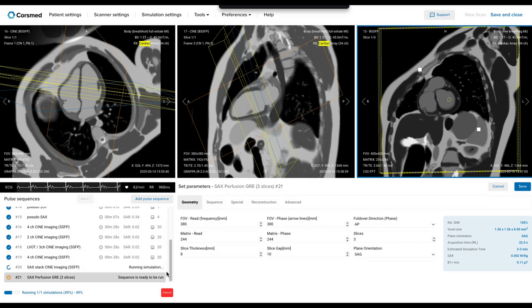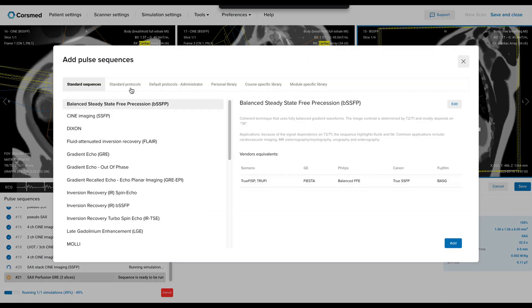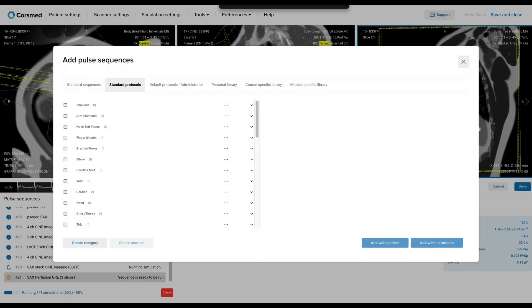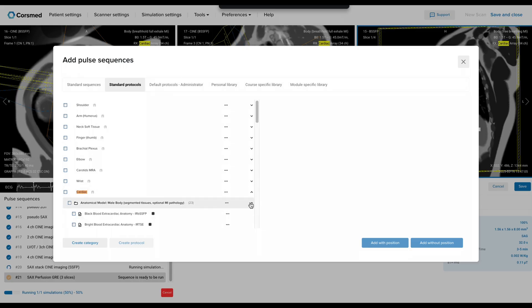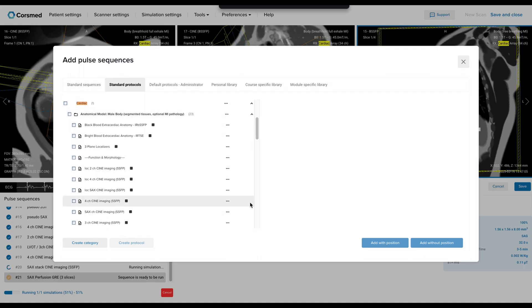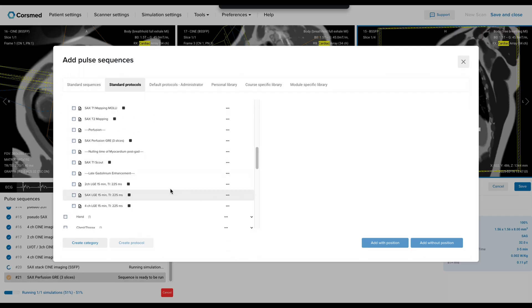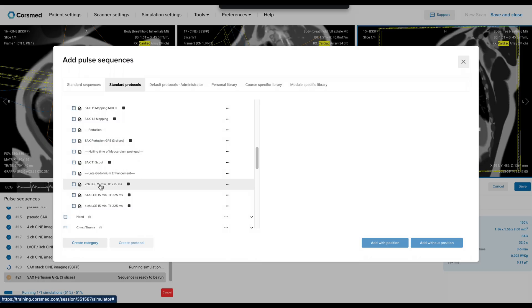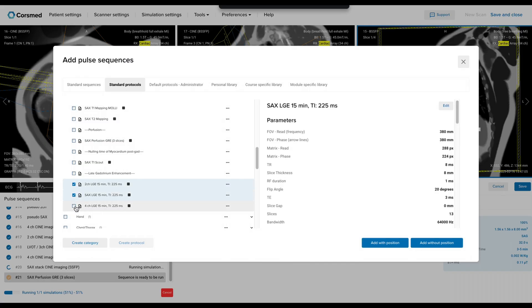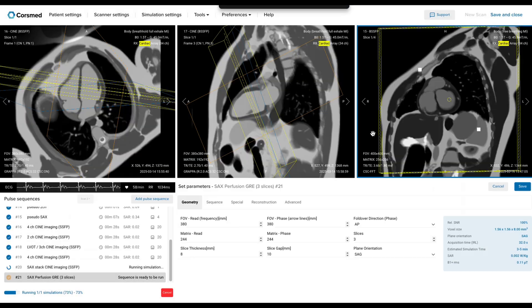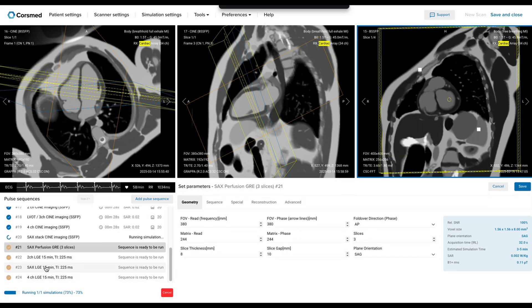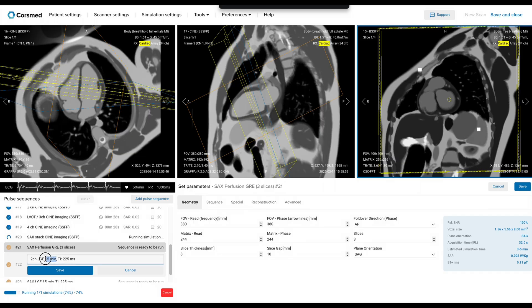However, right after perfusion finishes, we must have our early enhancement sequences already set up. These early sequences show microvascular obstruction, or MVO — areas where contrast can't penetrate due to severe damage. I'll take these early gadolinium sequences and add them with position so we have them ready to go.